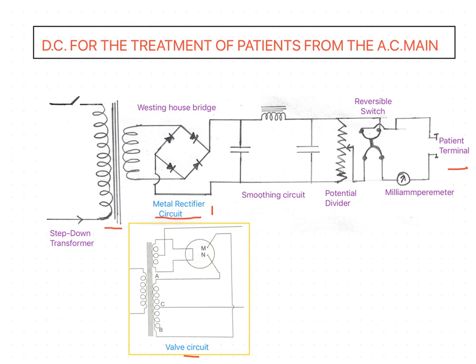From this step-down transformer, the alternating current is passed, which reduces the EMF to approximately 110 volts and makes the current earth free at this stage. And tappings on the primary coil of the transformer, so here we can tap, enable the apparatus to be used on supplies of different voltages. So this can be done at the step-down transformer stage.